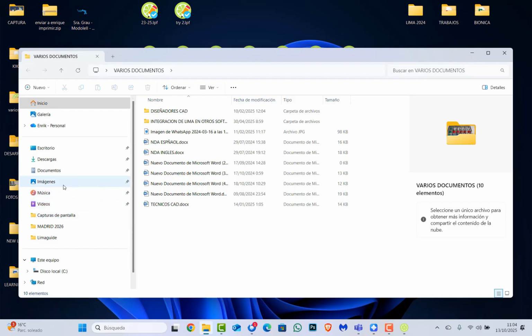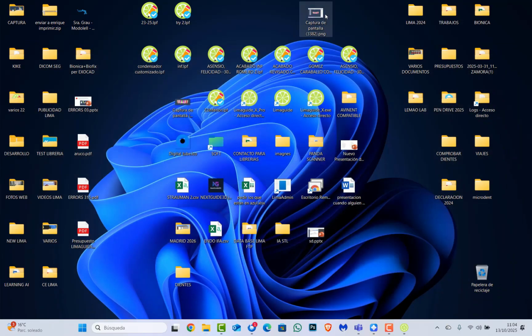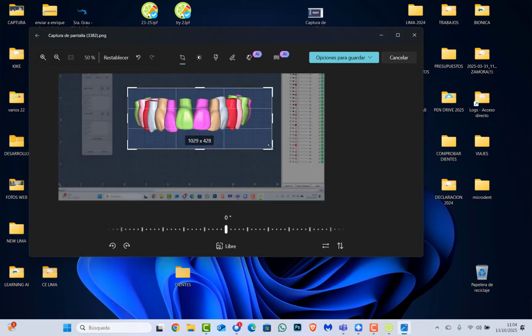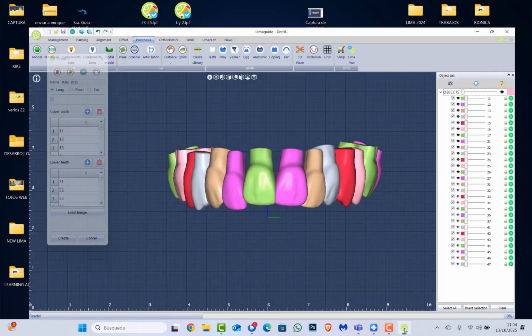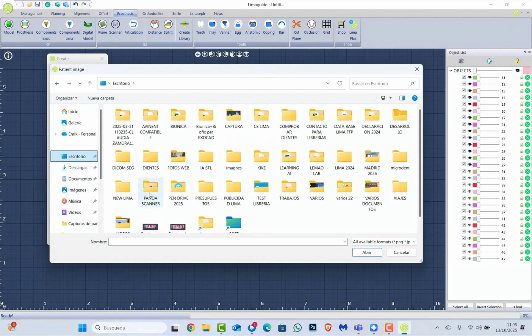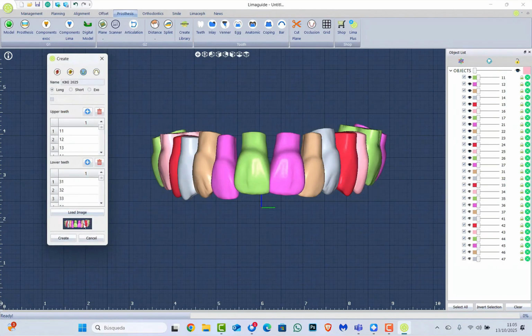Now I'm going to open my screenshot. And then I'll crop it. So then I upload my picture. And now I will have this picture as my reference for this library. Then I click on create.